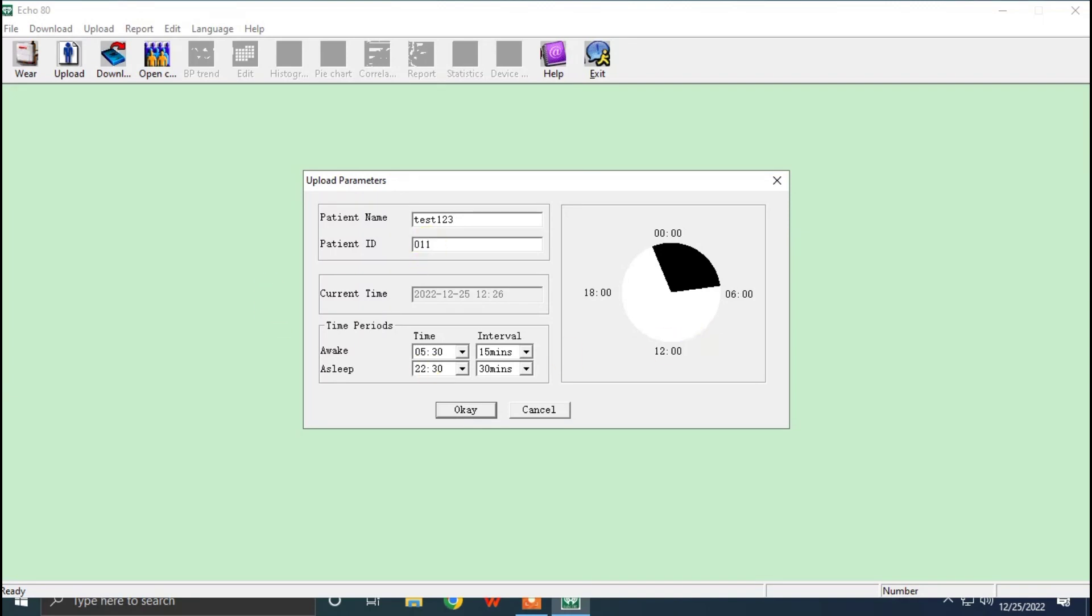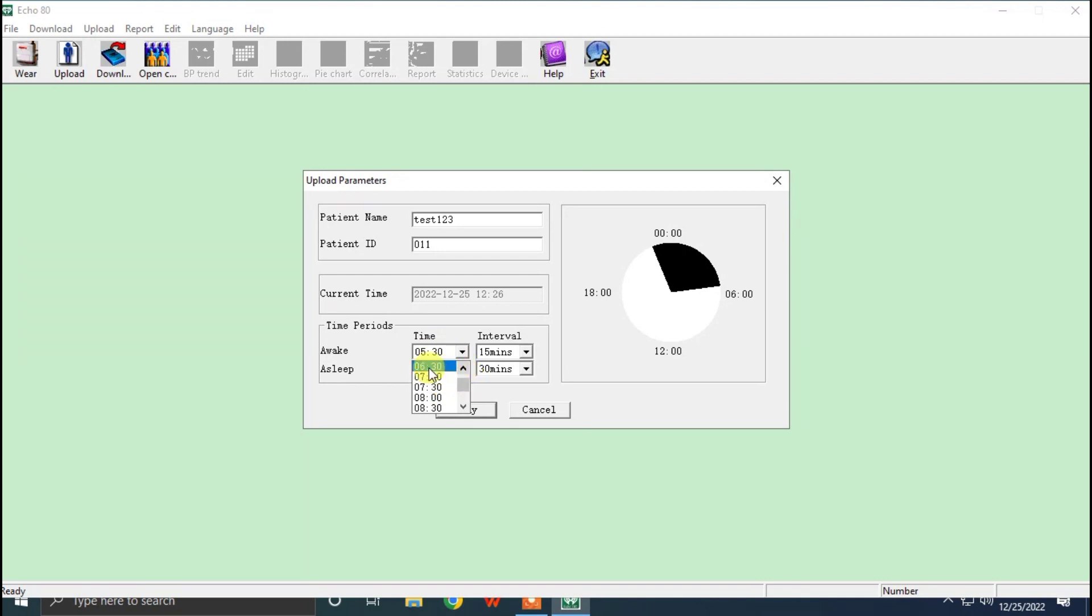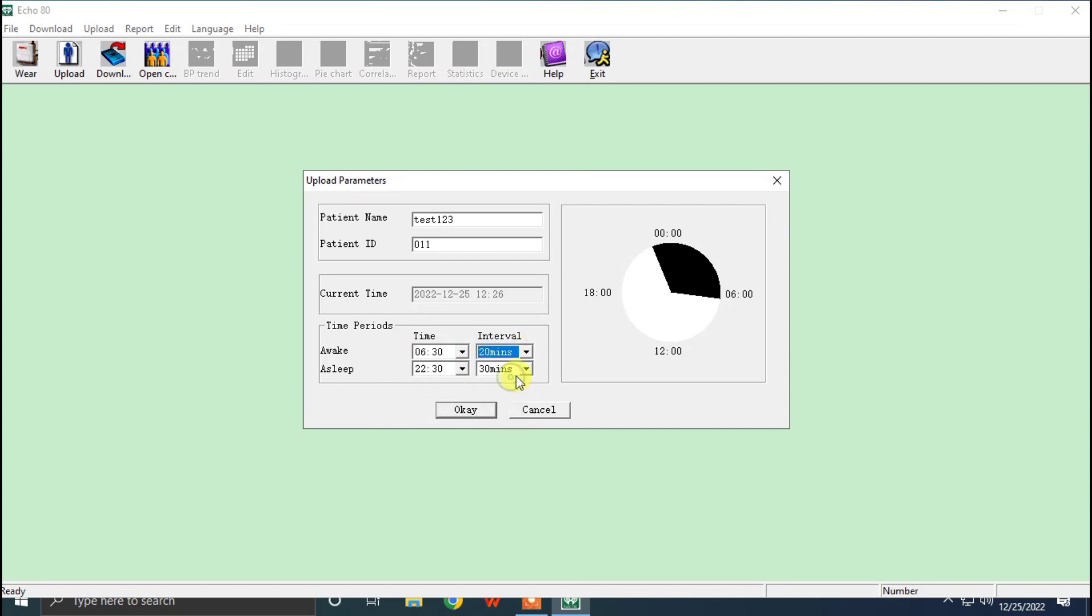There will be a specially defined time interval in this time, and asleep time means sleeping time. So we can define the intervals in awake time and asleep time.